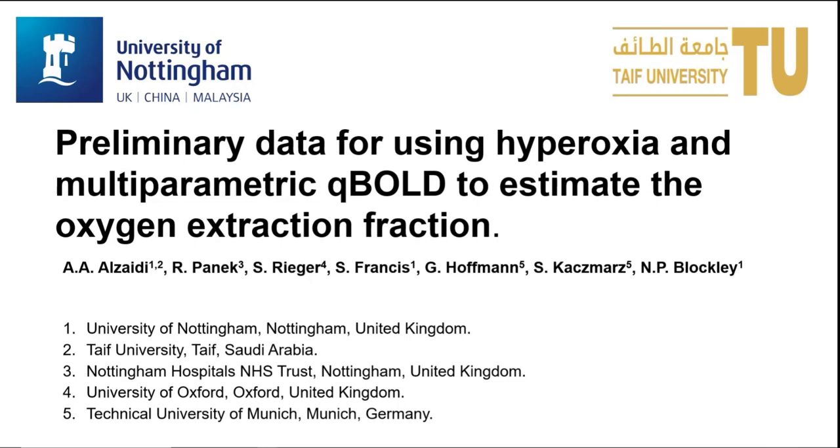So I'm really talking about kind of a work in progress here. We've been looking to use hyperoxia as a contrast agent, which we've done before in the past, but combine it with what's called a multiparametric qBOLD acquisition in order to try and measure oxygen extraction fraction and hopefully make this a more widely applicable technique.